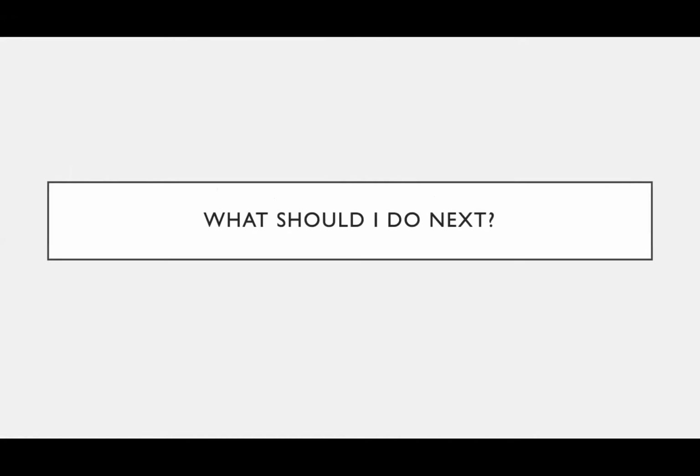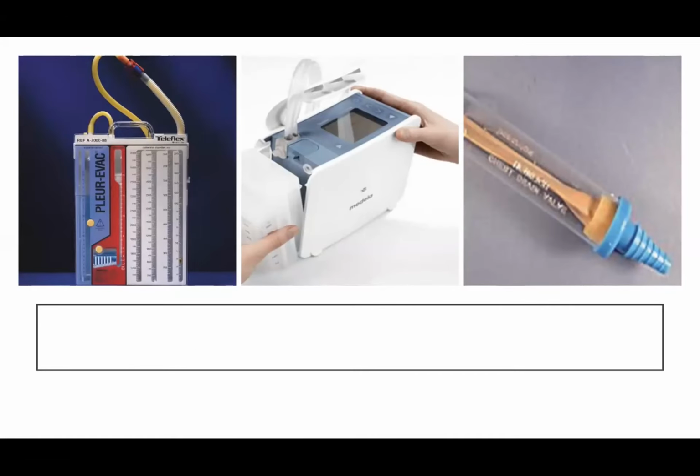Okay, so after that is the most important thing. What should you do next? So you have different methods. This is the most common underwater seal system, the 3-chamber system that we are using, and most of us know about it. Most recently, they have this nice electronic machine that we are actually using in our hospital.